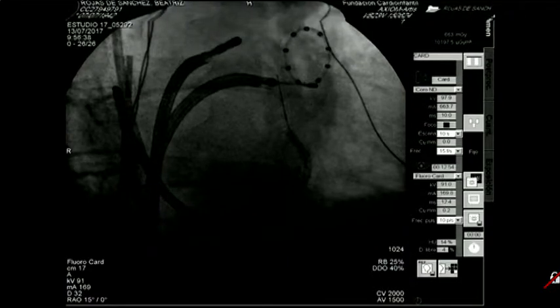No es que estas señales vengan directamente de la vena de Marshall como estructura eléctricamente activa, sino que simplemente es un vehículo para llegar al epicardio. Tenemos publicado, está en prensa en Jack, todo un atlas de la anatomía venosa, de todo lo que hemos aprendido inyectando contraste en la vena de Marshall y en otras.